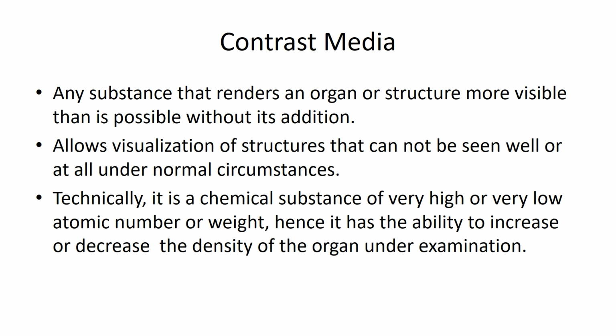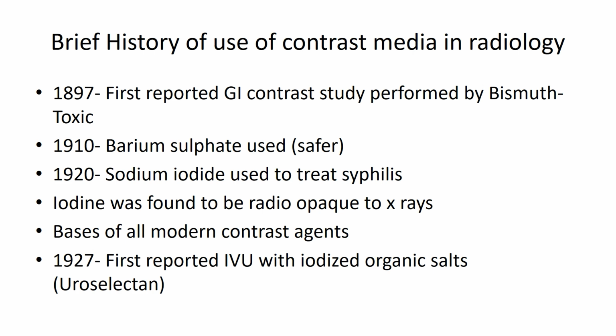It also allows visualization of structures that cannot be seen well under normal circumstances, that is, the plain radiograph. Technically, it is a chemical substance of a very high or very low atomic number or weight. Hence, these chemicals have the ability to increase or decrease the density of an organ under examination.